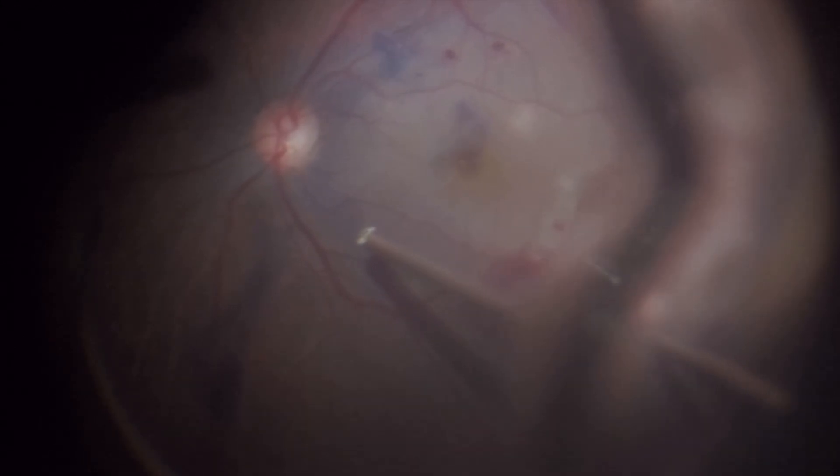Note that at the end of the peeling and trimming steps, a small flap remains adhered to the inferotemporal edge of the macular hole. It is crucial during the fluid-air exchange to maintain aspiration in the superonasal quadrant so that the direction of flow generated by the vacuum of the vitrectomy probe helps keep the flap positioned over the macular hole at all times.